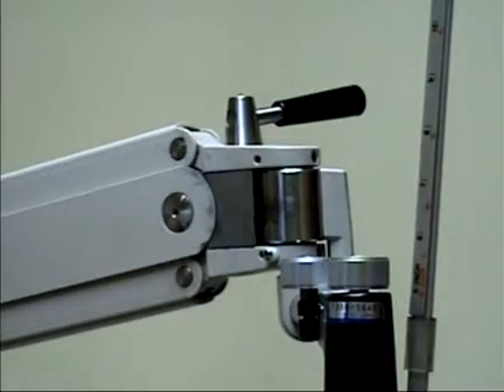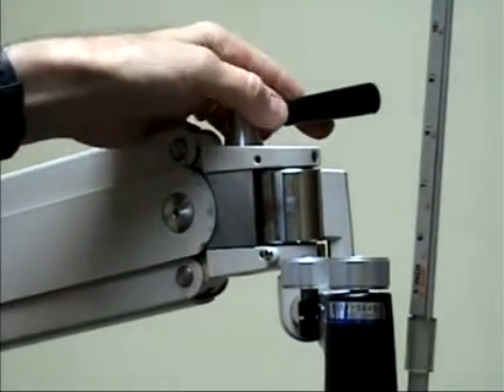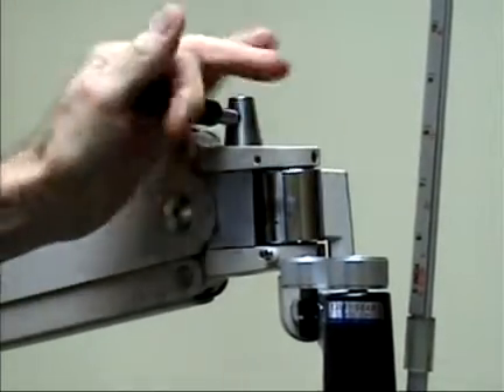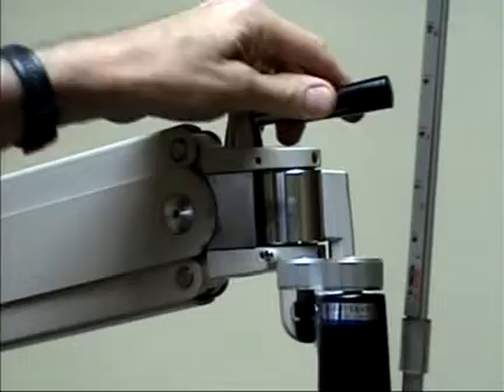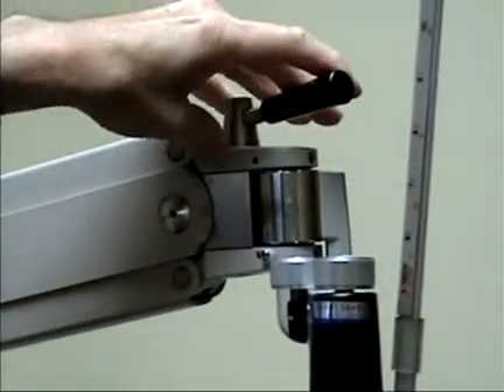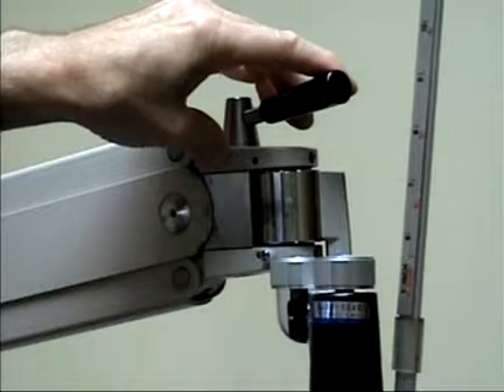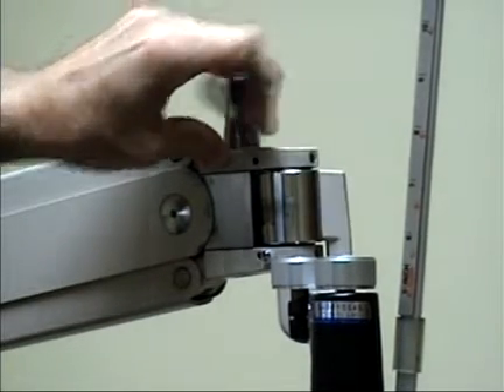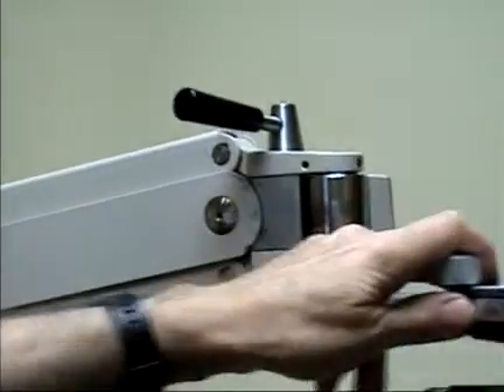The idea is to get the lever to lock without crossing over to the other side. If the adjustment is too loose, it sort of locks the arm but not with full force, and then pushing a little further actually flips to the other side and it's now loose.